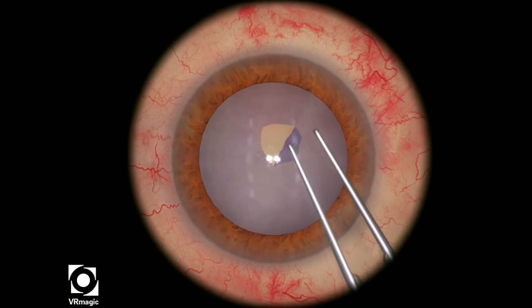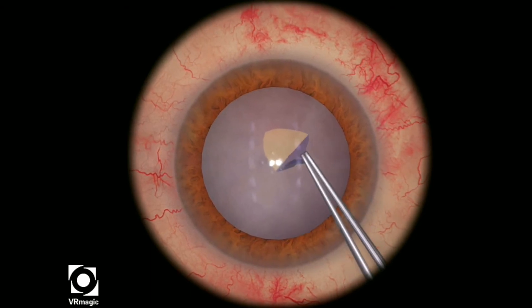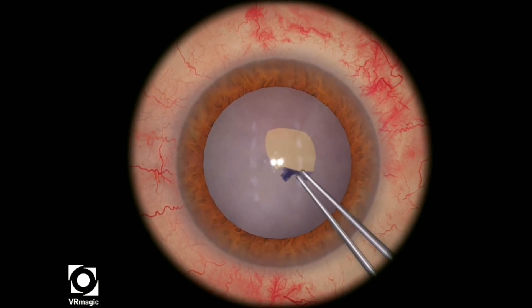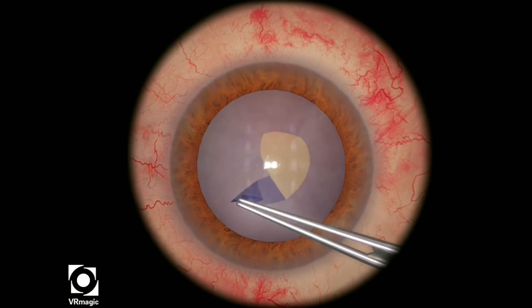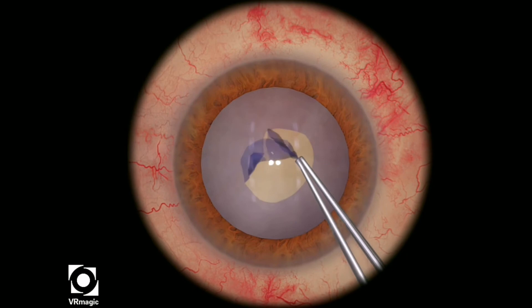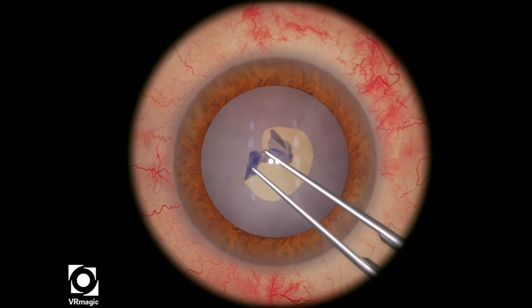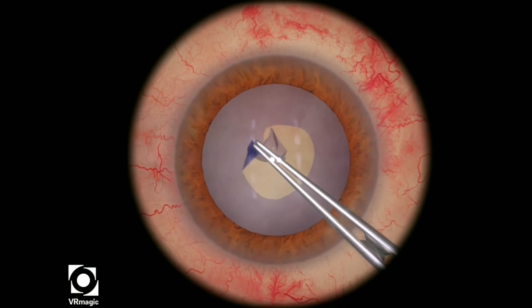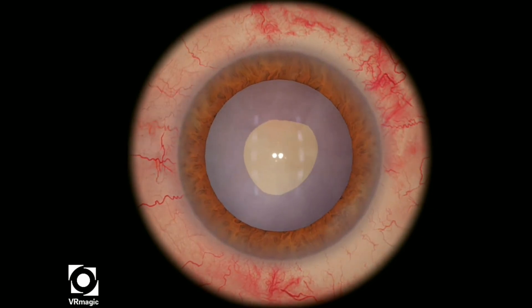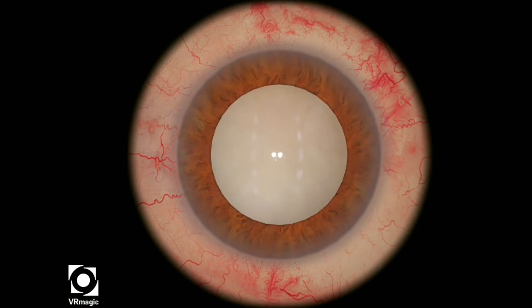You want to be very gentle because the capsule is very brittle. I find it's very difficult to pull and create the shape that I want to, so you have to be as gentle and cognizant of where you're going. If the rhexis doesn't look very regular to you, then stop and try to readjust to make sure that you get the circular shape that you want. Here it looks okay, but it could have been a little bit better near the bottom.